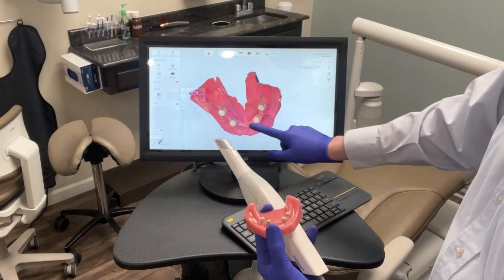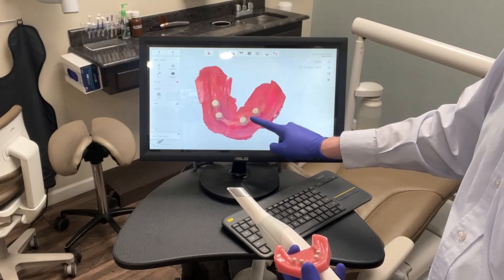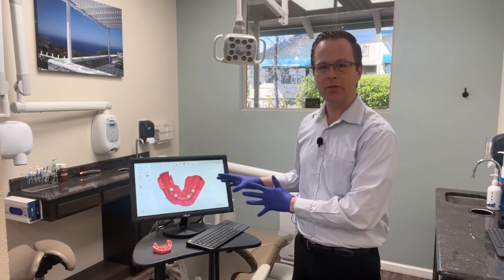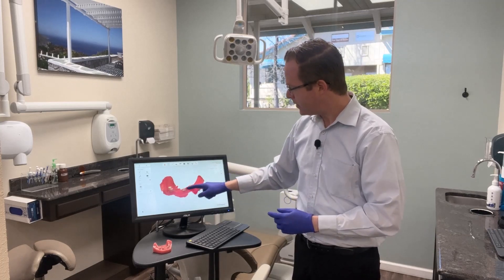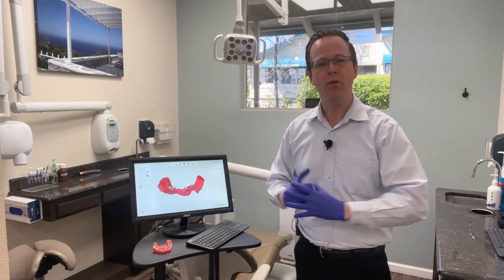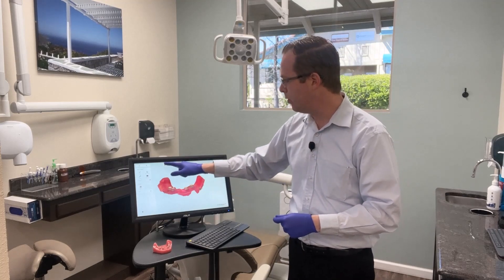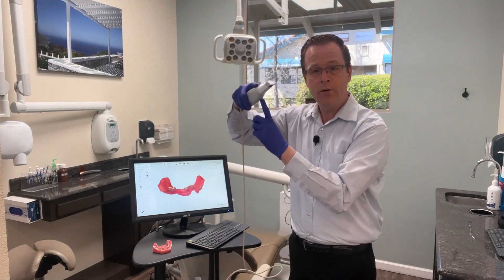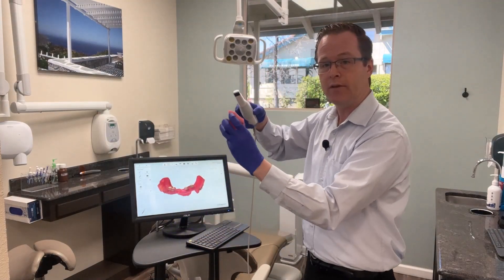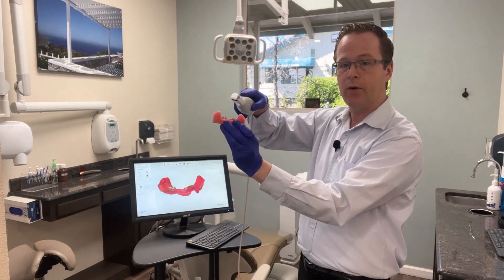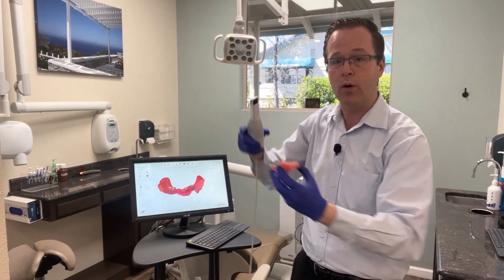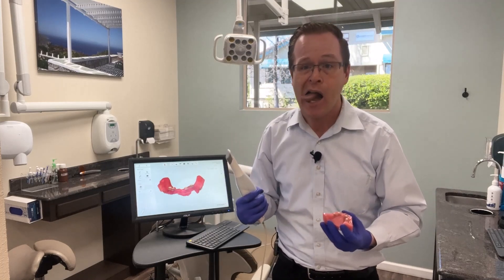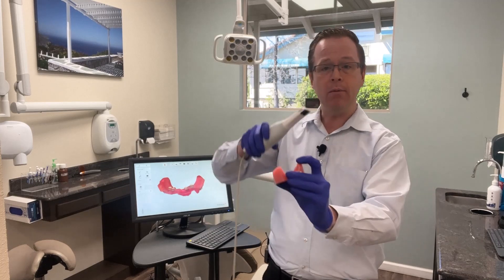Turning off my scanner, I can see I've captured the edentulous ridge sufficiently. Once I capture the edentulous ridge, I can see I'm working on a model. But let's go through an actual patient. As I was taking my intraoral scanner, it's really straightforward — all I'm doing is changing the optical position of the scanner as I'm moving back and forth. Tracking — when I notice the patient is going to be moving, no problem, I back away and then go back down. If I notice I'm picking up a little bit of tongue on screen, I back away, then go back down.